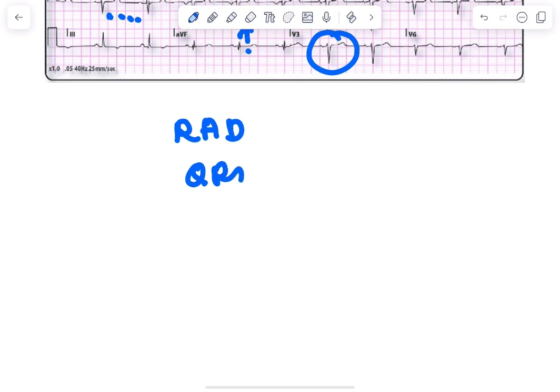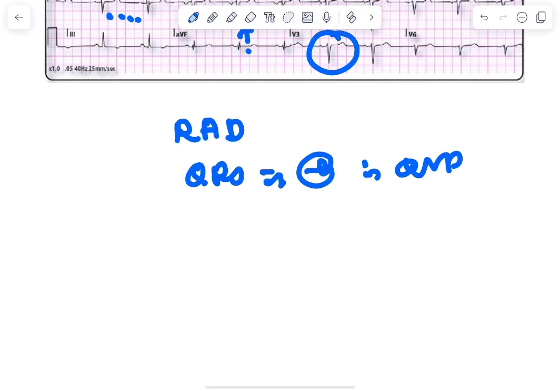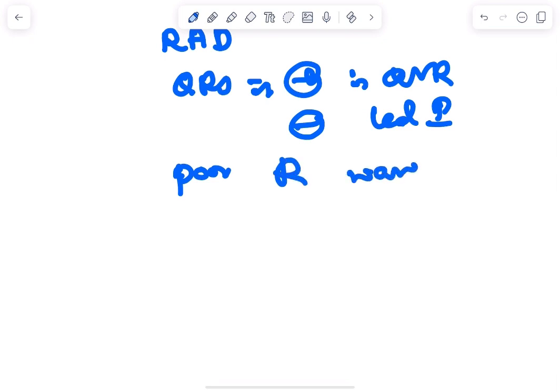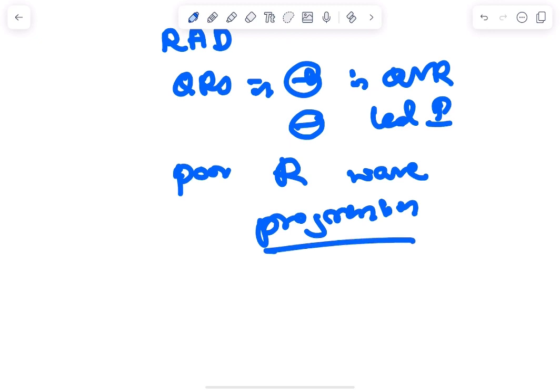Second, QRS is positive in aVR and negative in lead I. And there is poor R wave progression. So these are the ECG features of dextrocardia.